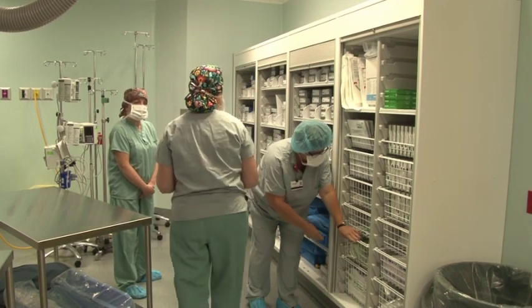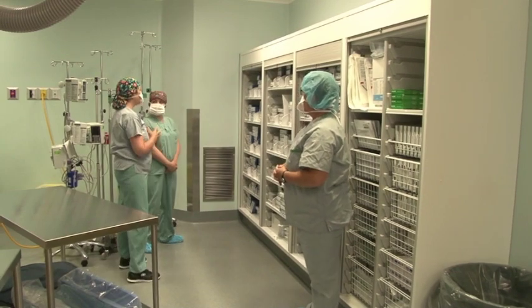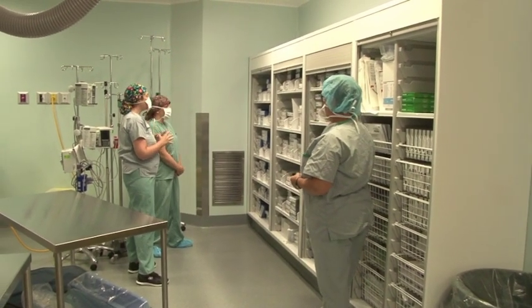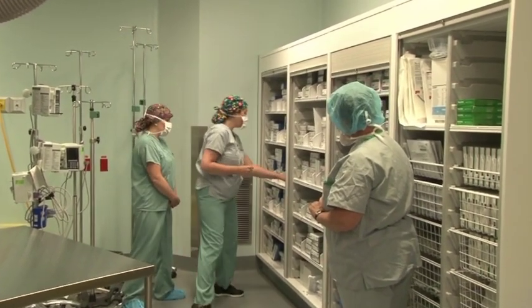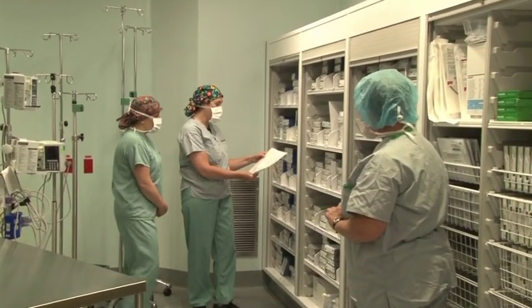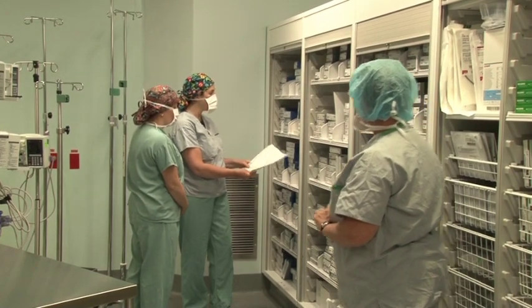How do you know which pacemaker to pick, Jane? Well, Dr. Toll will decide. Whoever the implanting physician is will come in and they will decide. Usually they have an idea of what they want. We do have some guides that have been typed up to give us a lot of information about what lead would go with what generator, so that's very, very helpful.